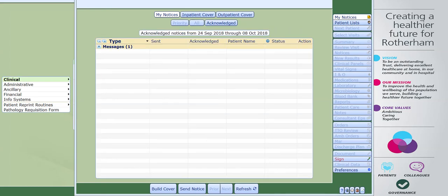You may also be required to build cover for other clinicians for this to work. If you're unsure on how to do this, head back to our video section and select Meditech build cover. Once you have your cover set up, you will be able to see the results for patients under your care along with those under the care of the clinician or clinicians you have previously built cover for.